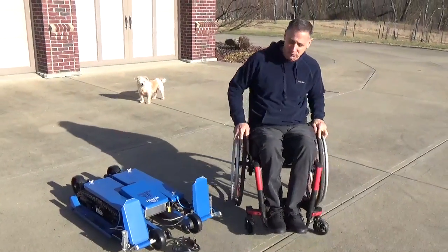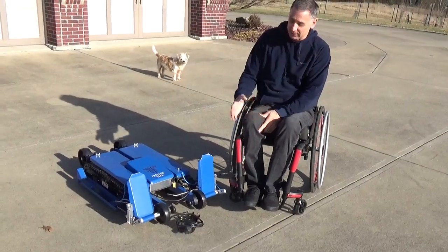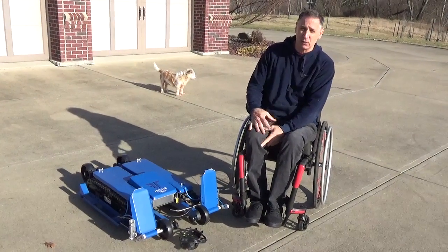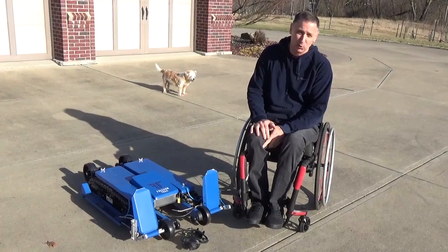This is a Freedom Trax. I just received it a couple days ago and I've been in it once before testing. I just want to do a little demo to show you what it does. The purpose of it is to give someone in a wheelchair maneuverability off-road, whether it be through sand, stone, sticks, the woods, uphill, or downhill.